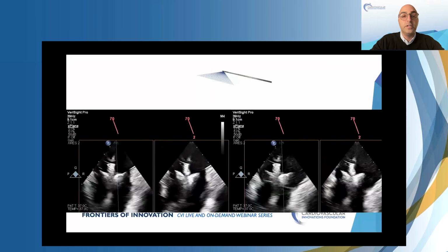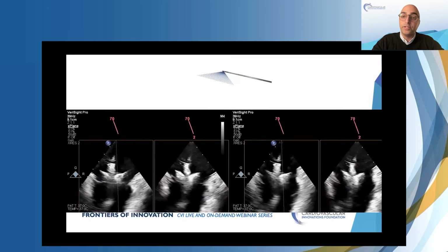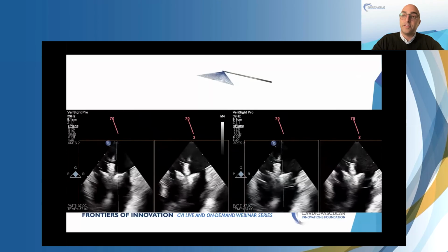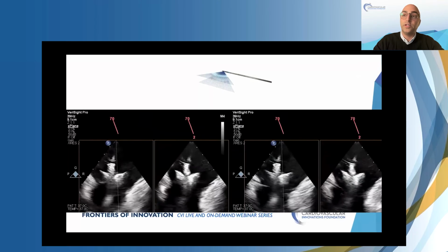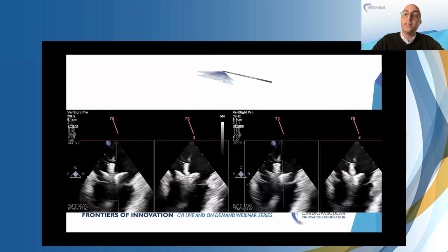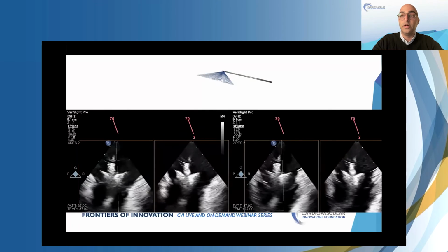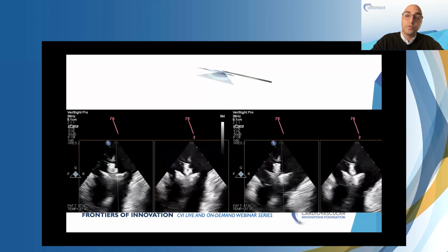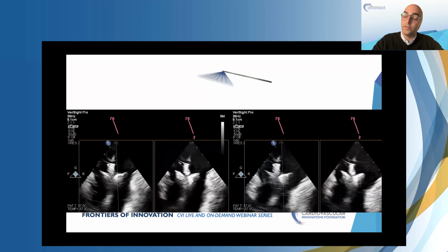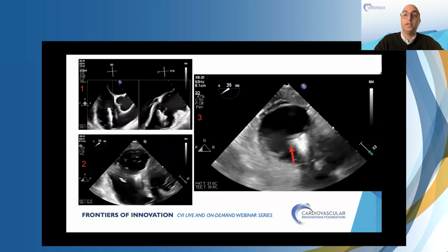And here's an example of it. So we went to 70 and what we utilized was the tilt elevation technique. So I really, really believe in this because if your X is not exactly at the clip, but 70 is the grasp angle, you can utilize tilt elevation and just sweep into the clip. And that's what we do here: I sweep into the clip and Gagan then checks the grippers. He checks the gripper for the septal leaflet and one for the anterior leaflet as well. So I really believe this is a really fundamental, logical method. You can use this beautiful method to sort of get to your grasp view without guessing. And I think that's the beauty of 3D navigation.